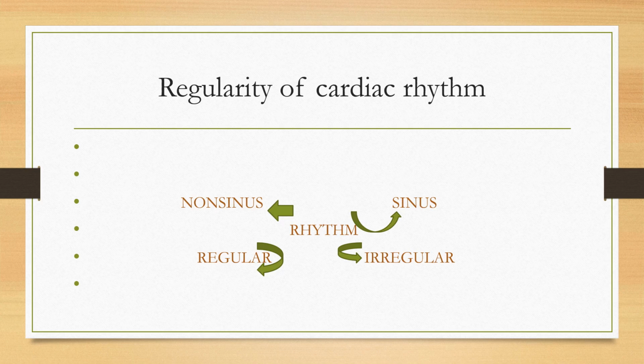When you see the ECG, you must start from the second standard lead. If the P wave is positive and it appears before the Q wave, then your conclusion must be that the rhythm is sinus. We can say the rhythm is sinus when the P wave is positive and always before the Q wave, and it means the impulse starts from the sinoatrial node.